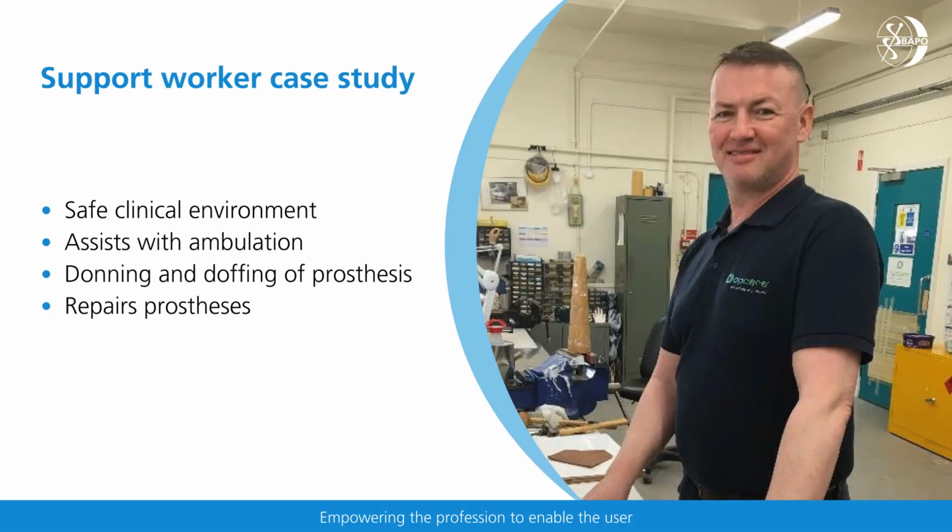This is Johnny, who has a clinical support role as a clinical support technician. In his role, Johnny has face-to-face appointments with patients whose prostheses need repairs and can see up to 4 patients a day depending on the demand. He ensures the clinical environment is suitable for the patient, helps them into the clinic room, and, if necessary, helps them to don and doff their prosthesis.